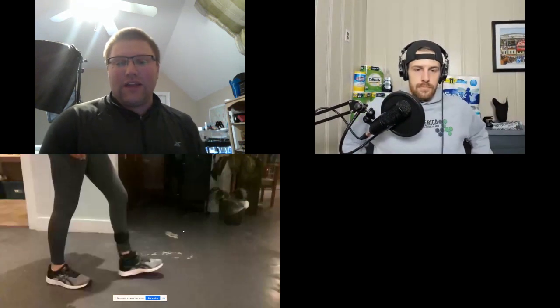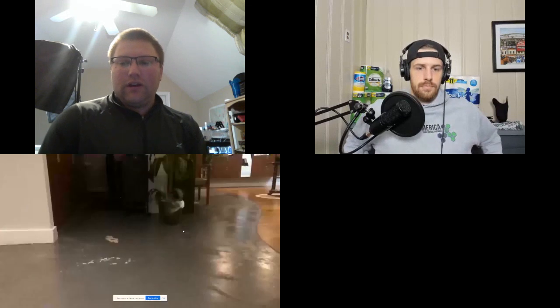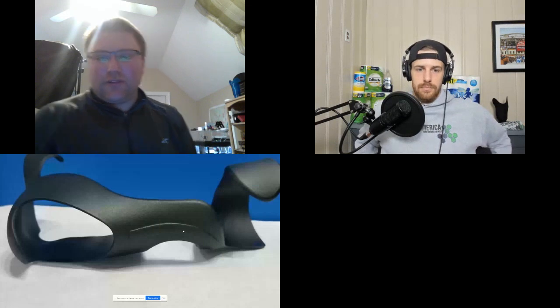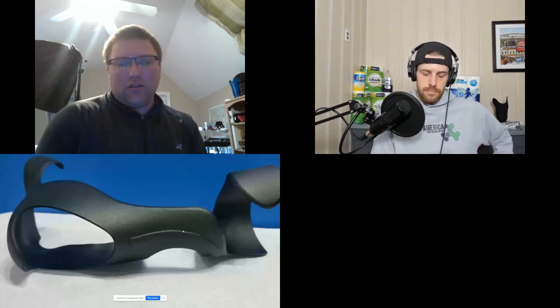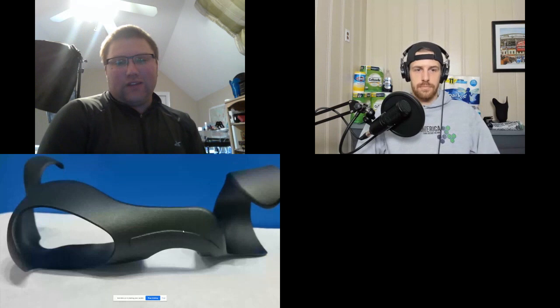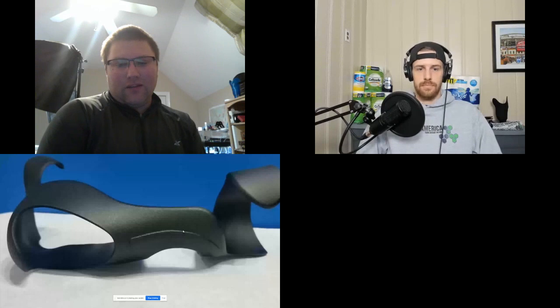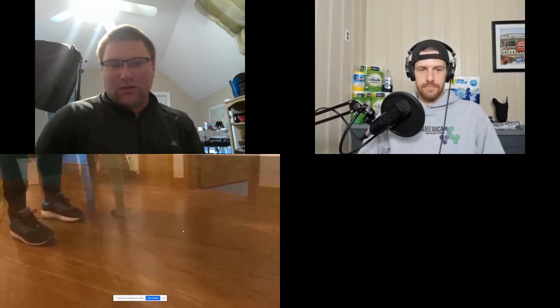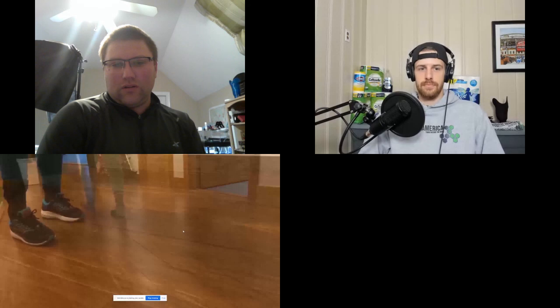Very smooth. And you see the dynamic nature of these multi-jet fusion AFOs. So this was actually the very first one I did. This was a difficult one that I did. She wanted a brace with her ankle with hiking boots. So before, and after.